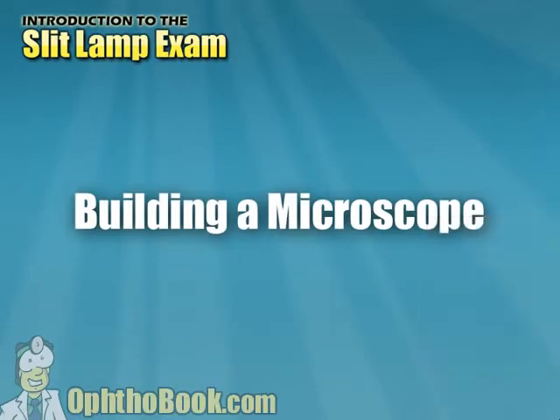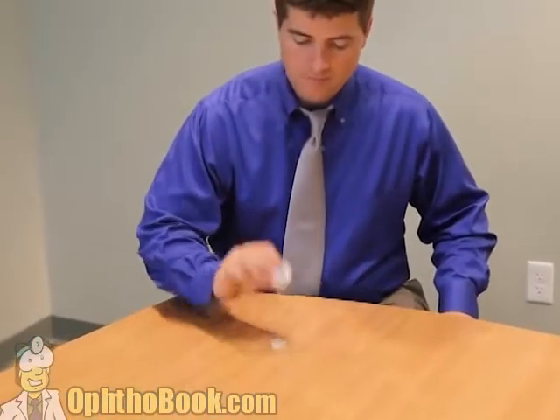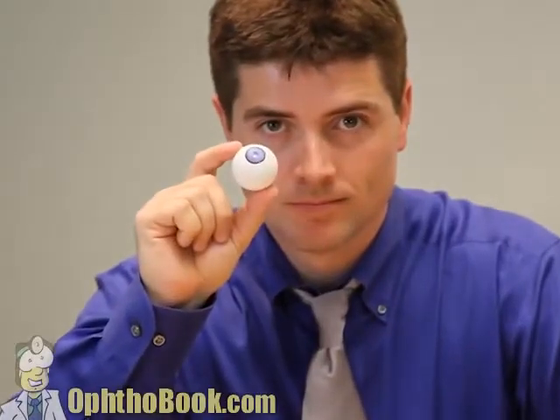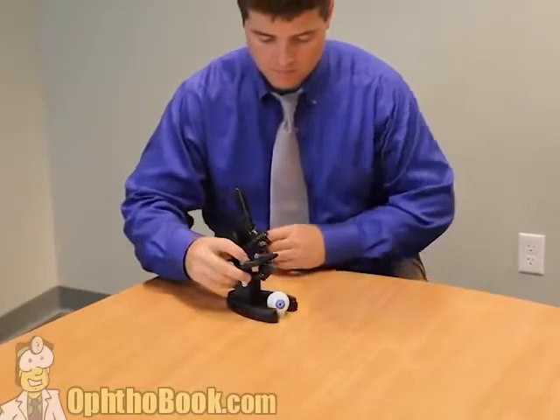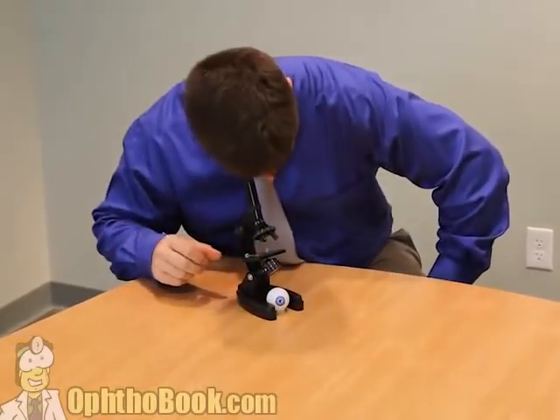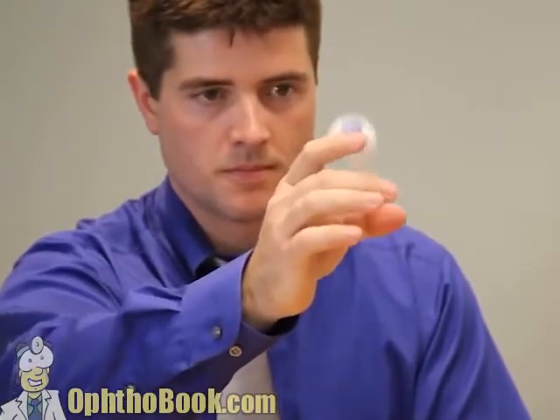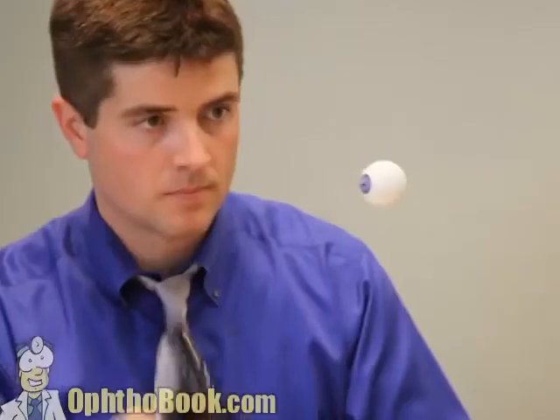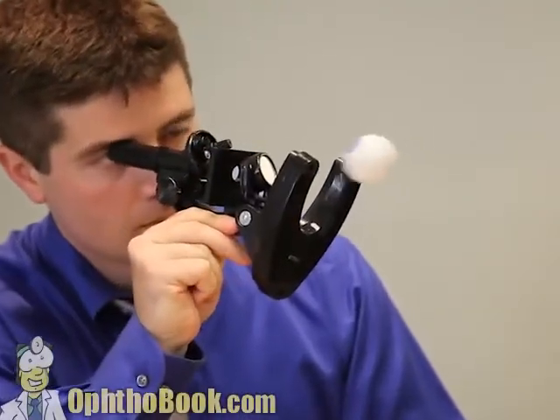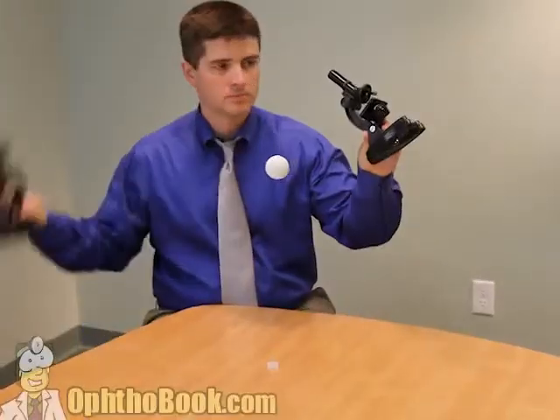Now, the eye, as we know, is a very small structure. It's about 1 inch in diameter. And in fact, the part of the eye that we look at, the anterior segment, is even smaller than that. So we really need a microscope to see what we're doing. We don't need a high-powered microscope. We're not looking at individual cells, but we certainly need one. But our patients don't like to lay flat. They like to sit up. And so we need to take a microscope and move it so it's in a horizontal axis so that we can look at the eye.